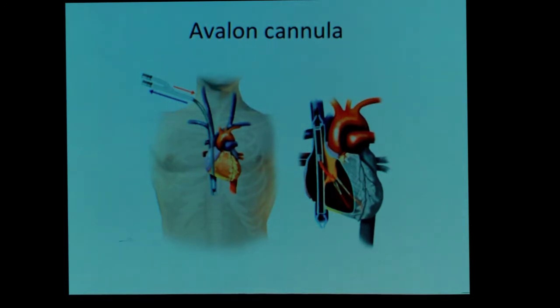Now, this is how a subcostal IVC window looks, and you can see the cannula occupying the IVC up to this point. I would say this is a bit pushed in too much. However, this is the outflow opening. You can see it clearly here, and this is the tricuspid valve and RV. So maybe it's not too bad, but maybe pulling it a little bit would be helpful. It's just to show you that transthoracic echo can be helpful to ensure this.